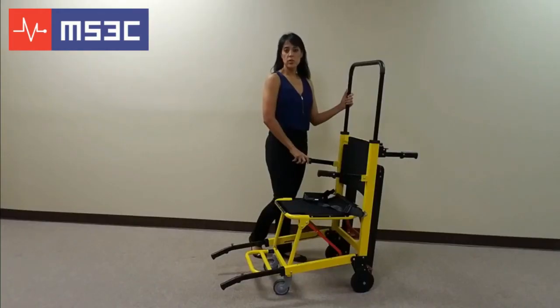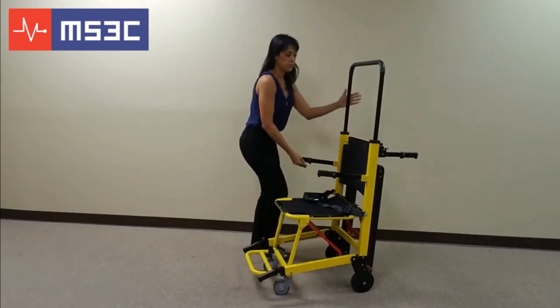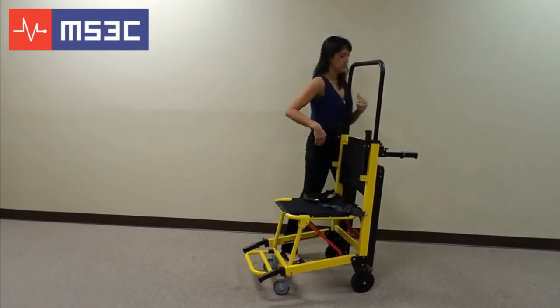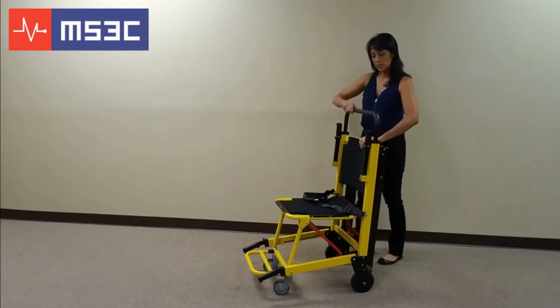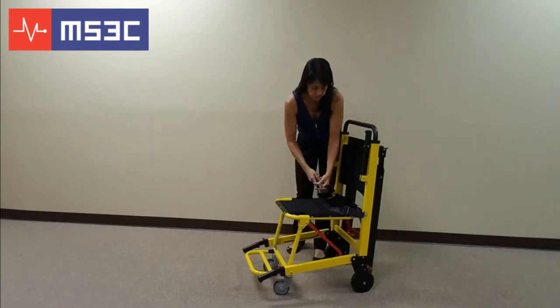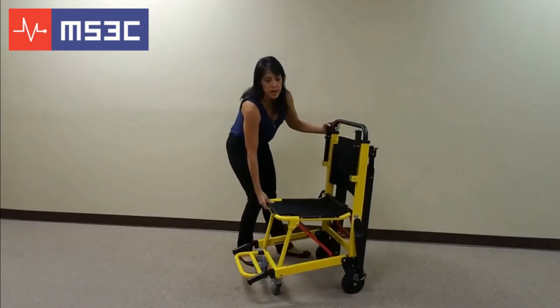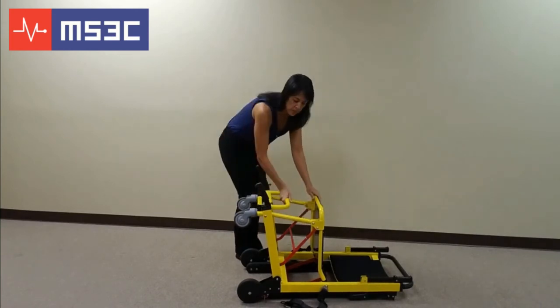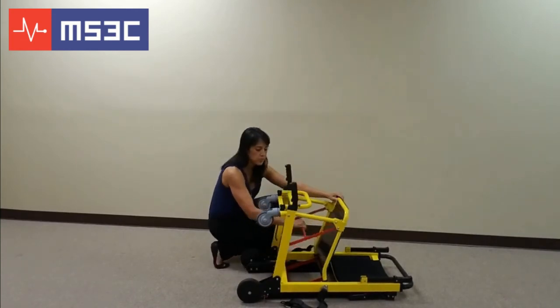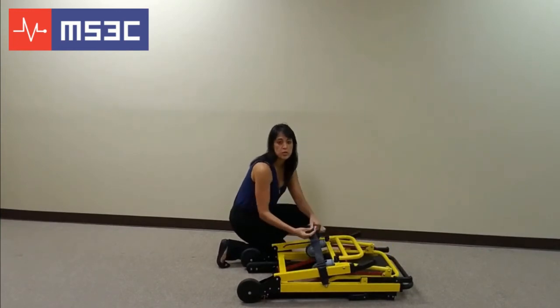To close and store the unit, make sure all of the control handles are in their closed positions. Release the seat belt. Tilt the chair onto its back. Push the red lever located under the chair, and use the seat belt to secure it in its closed position.